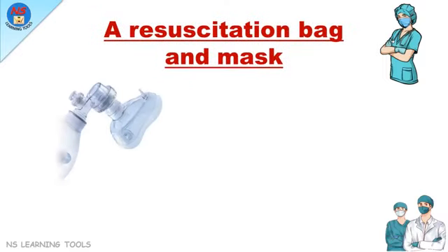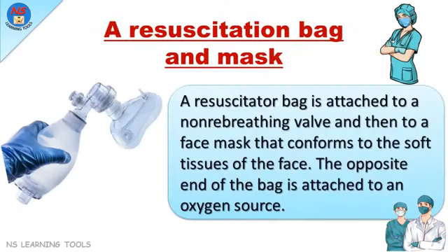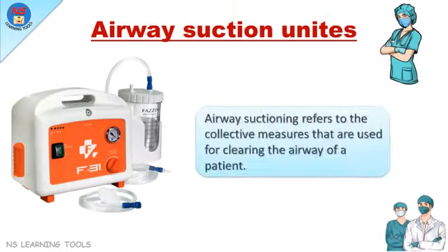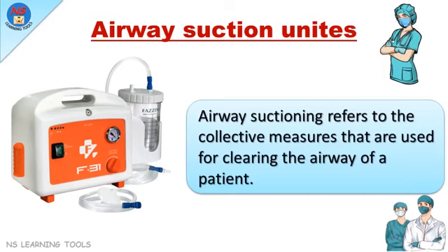A resuscitation bag and mask. A resuscitator bag is attached to a non-rebreathing valve and then to a face mask that conforms to the soft tissues of the face. The opposite end of the bag is attached to an oxygen source. Airway suction units. Airway suctioning refers to the collective measures that are used for clearing the airway of a patient.